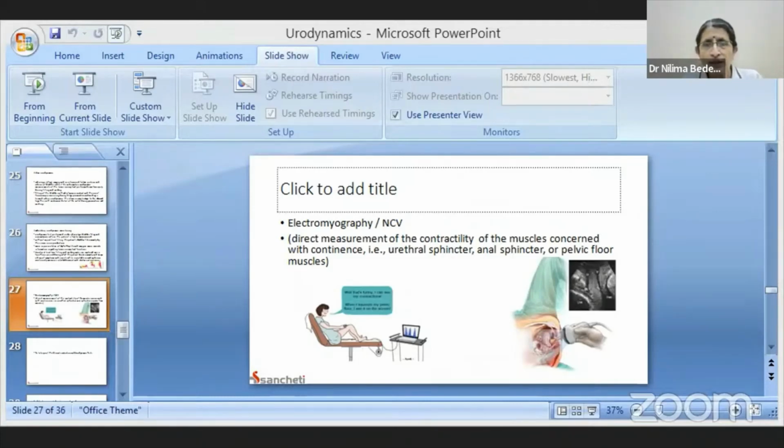So the bladder compliance also can be studied. If there is dyssynergia, it can be checked on the uroflowmetry. Uroflowmetry is another urodynamic test. It's not invasive. The person is evacuating the bladder naturally, sitting on the toilet seat, but the person should be relaxed and feel comfortable, and it should be as natural as possible.